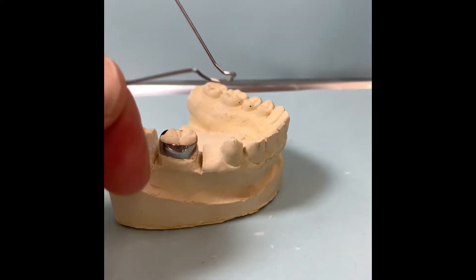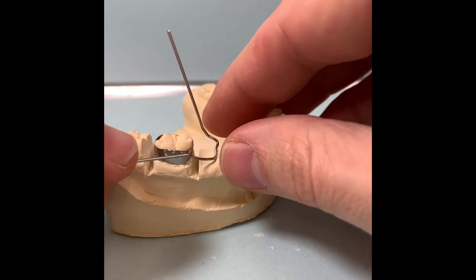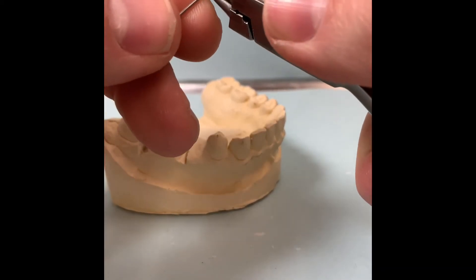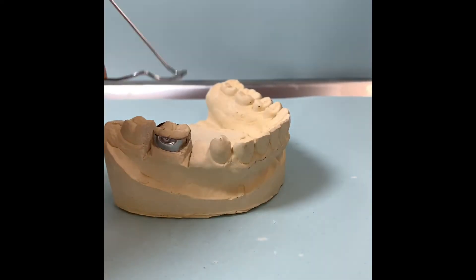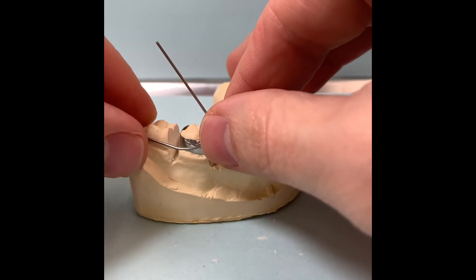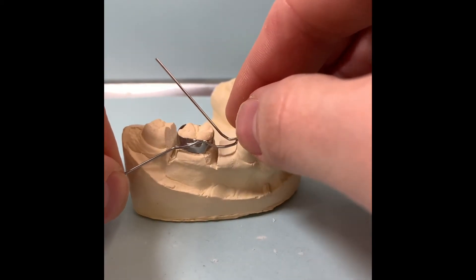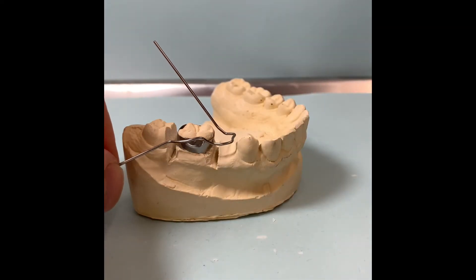Hold it straight, and then a 90-degree bend in the middle of the band, and then contour it around the band. You're going to have to use your bird beak or number 139 plier, and then just little bends to contour it around the wire. You might have excess in the back here, so just hold it, push that out, and then continue the contour so that it fits perfectly around the band.